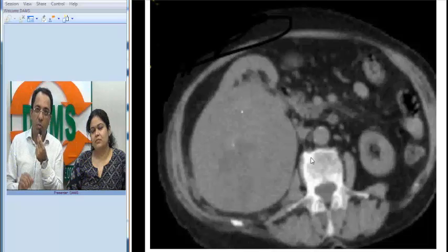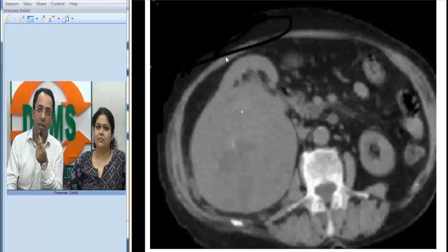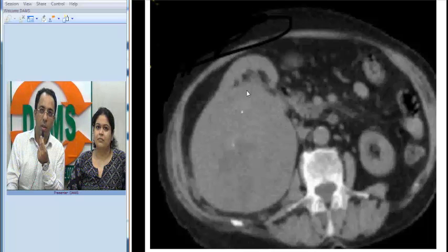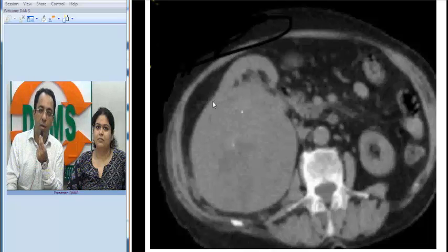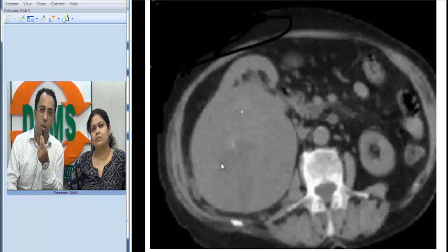We are looking at a non-contrast CT of the abdomen. You can see the vertebra, the psoas muscle, and the left kidney. The right kidney has been displaced by a well-defined, almost iso-intense mass. The key thing to note is that there is no plane between the lesion and the kidney, so it is probably a renal origin mass — relatively well-defined, almost homogeneous, but the central part shows slightly reduced attenuation, suggesting a central scar.